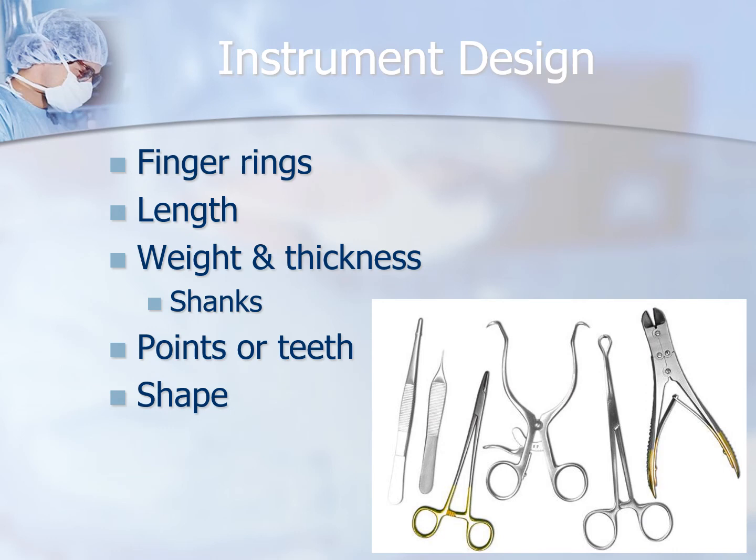As far as instrument design, we've already talked about this, but instruments have anatomy, right? The ones that have the ratchets and our scissors, they have those finger rings. They come in different lengths, different weights and thicknesses. Some have teeth, some don't, and they have a variety of shapes.